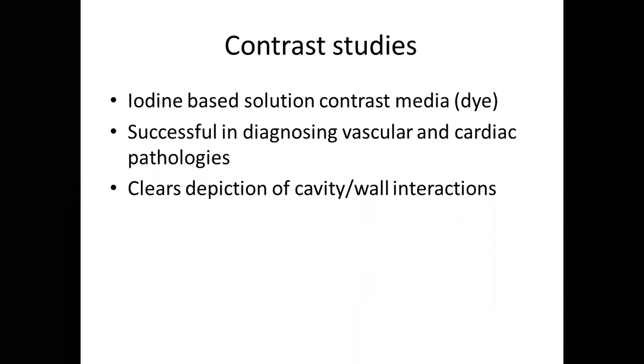When we are talking about radiography, cardiovascular system imaging is unimaginable, I think, without contrast studies. And for the CVS, we are using iodine-based solutions.